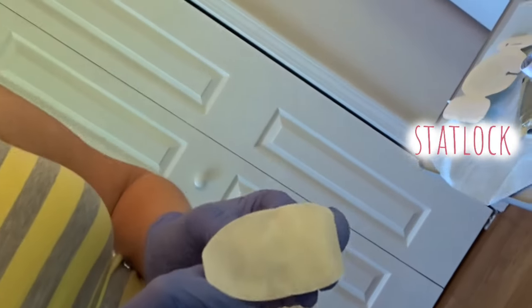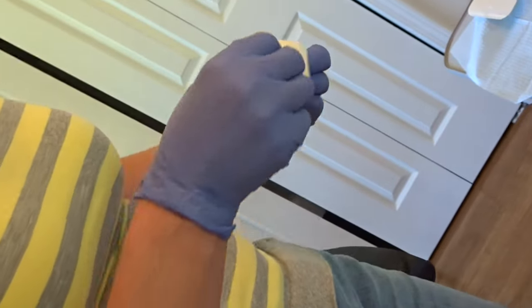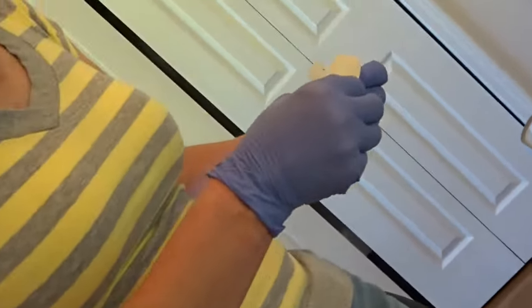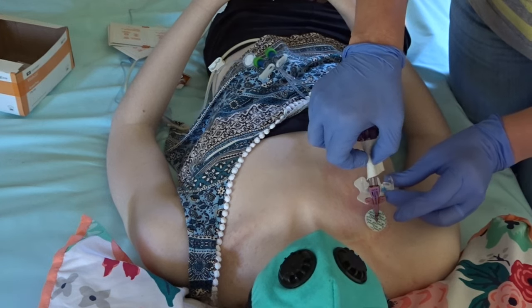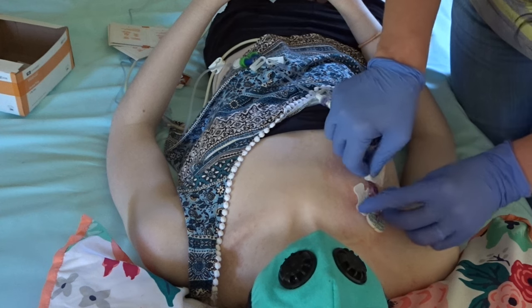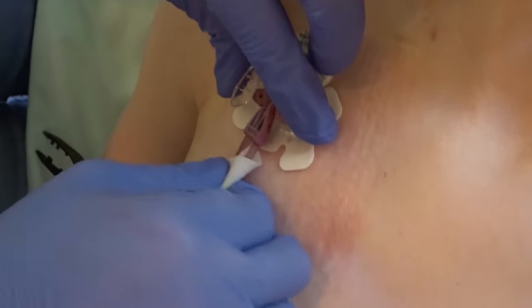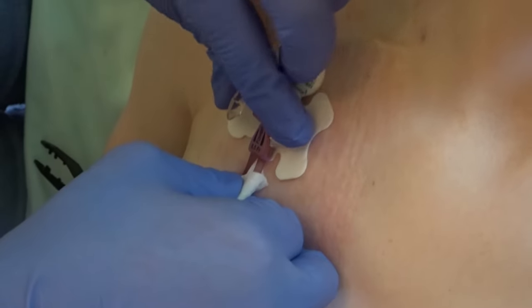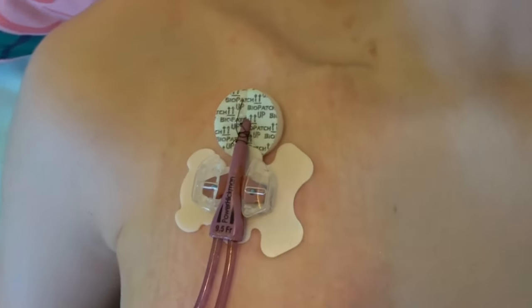Next, grab the stat lock from the sterile field. Although my line is annoyingly stitched in place, I like to have the additional support of the stat lock. Place the stat lock and sit the wings of the line in position, then push down to clip it in place. Again, use sterile gauze if you must move the line. How cute is my pediatric teddy bear stat lock.